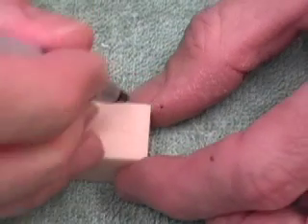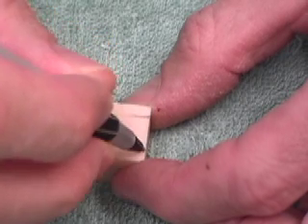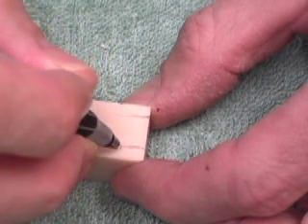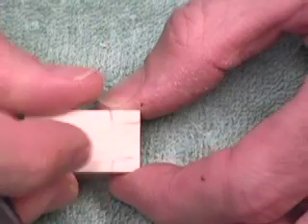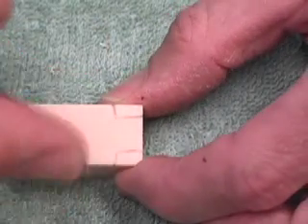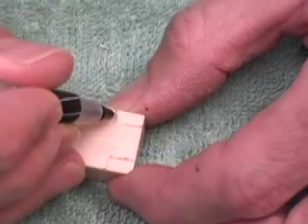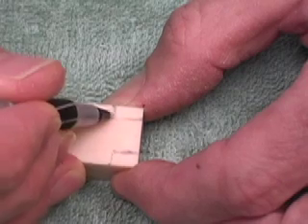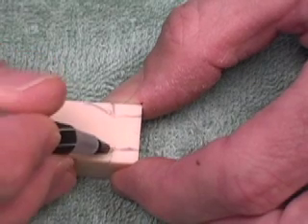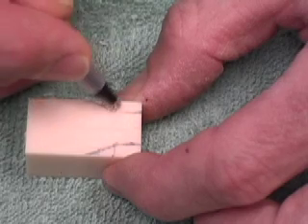We're going to form a shoulder, just like we've done on some previous assignments. The square is going to form a shoulder. These are the areas we'll be removing the wax.